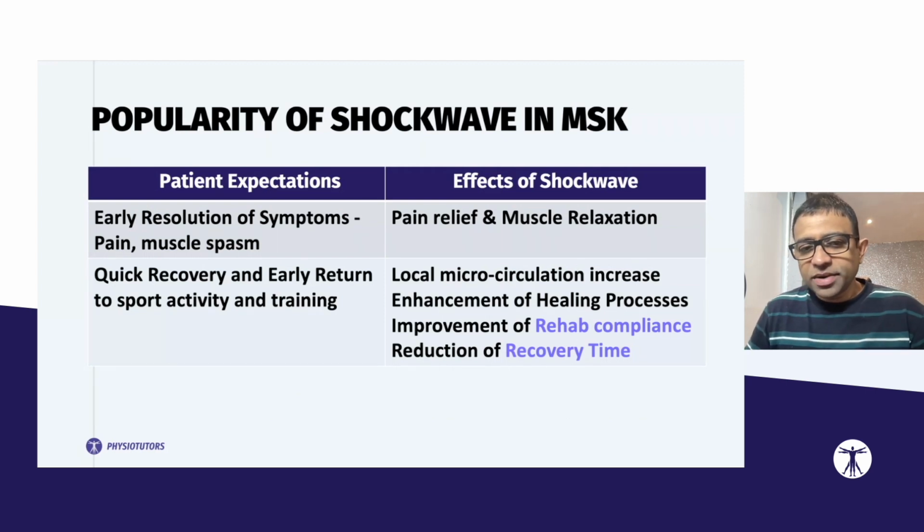A key factor, which I will not mention on the slide, is also the cost. Historically, about 10 years ago, these machines used to be very expensive and tend to be very big, cumbersome, and very hard to move around. Now we get portable units. I have a portable unit in my clinic, and it's easy to transport between two places. Also, what we see is it leads to quick resolution of symptoms. People don't want to go in for steroid injections and long recovery following injections like PRP, which can be much more expensive. And also patients want to get into rehabilitation and an early return to running or sports.